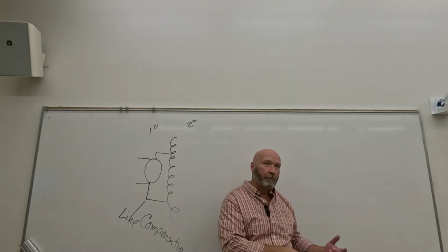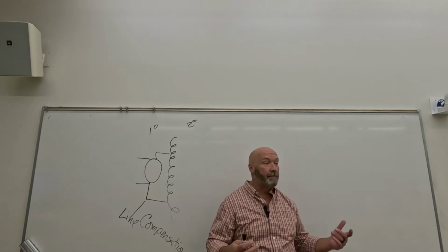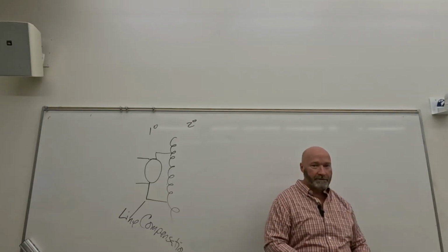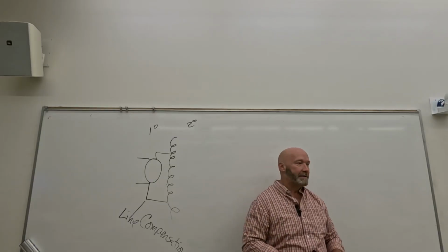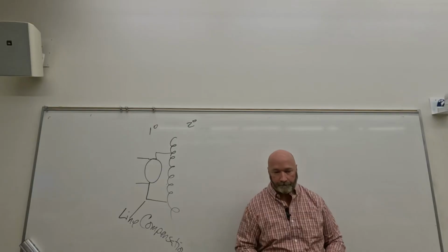In the reverse of that, if you take electric energy and you make mechanical energy out of it, that's a motor. That's pretty much a backwards wired generator. But what we're taking is low voltage and making high voltage out of it. In that context, it is a generator. It's generating very high voltage, kVp.